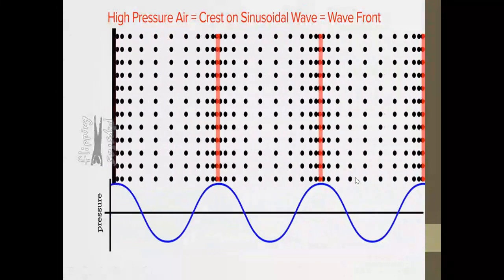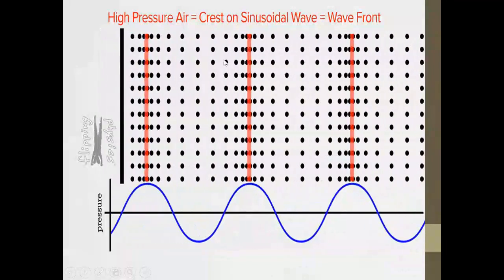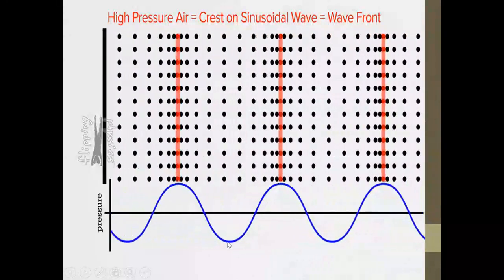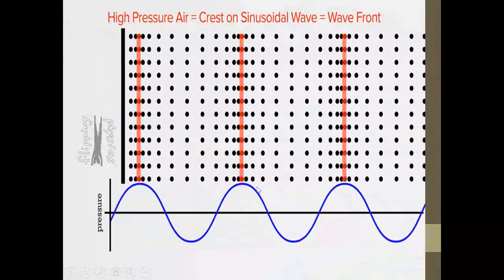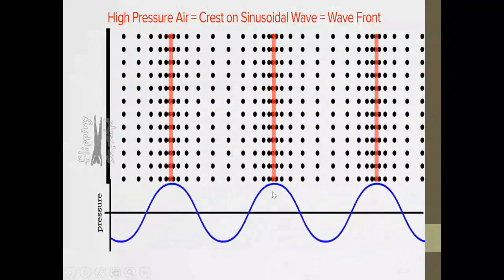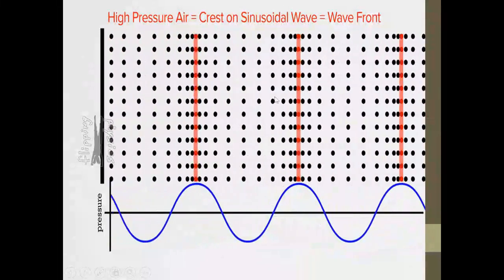On the other hand, the part with rarefactions, which you see, is the part I refer to as rarefaction. This is the bottom of the peak of my ultrasound beam, right? So it takes the shape of a sine wave. This is the direction of propagation.